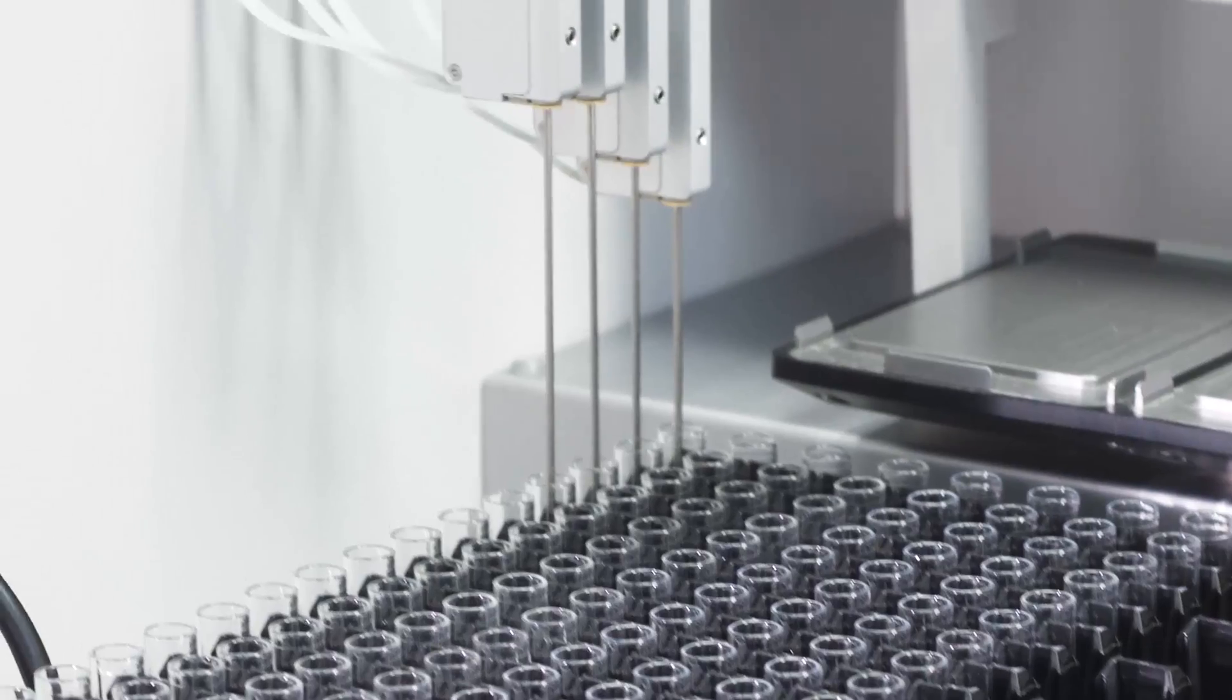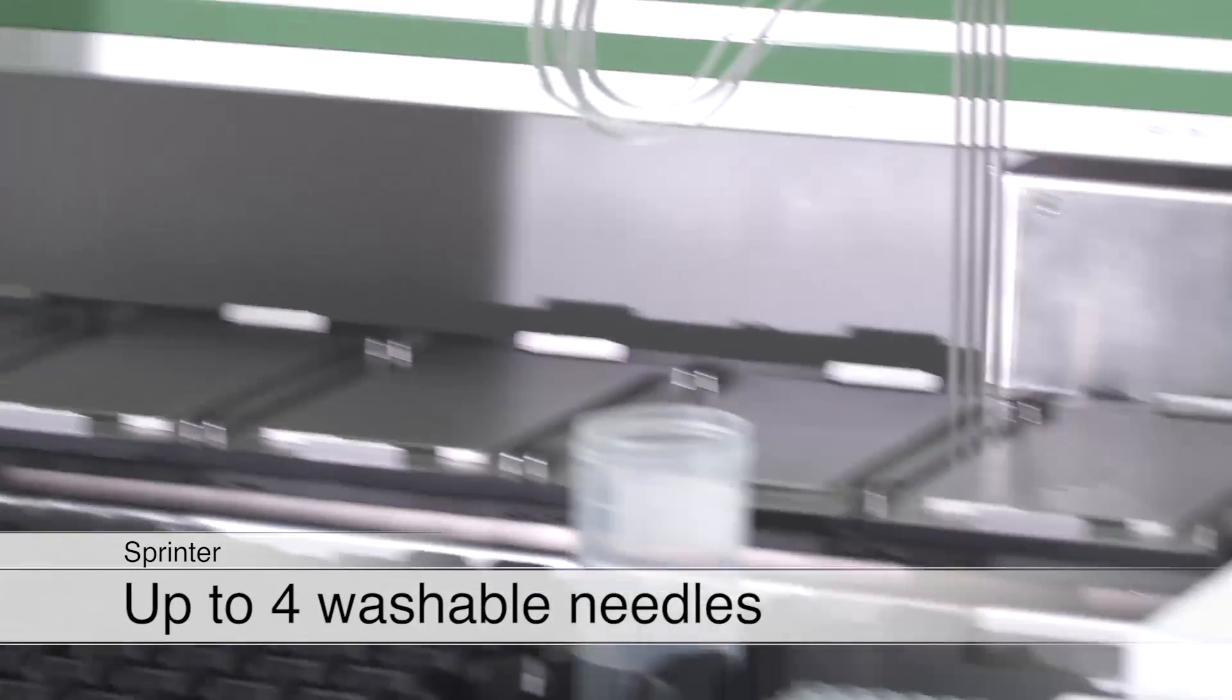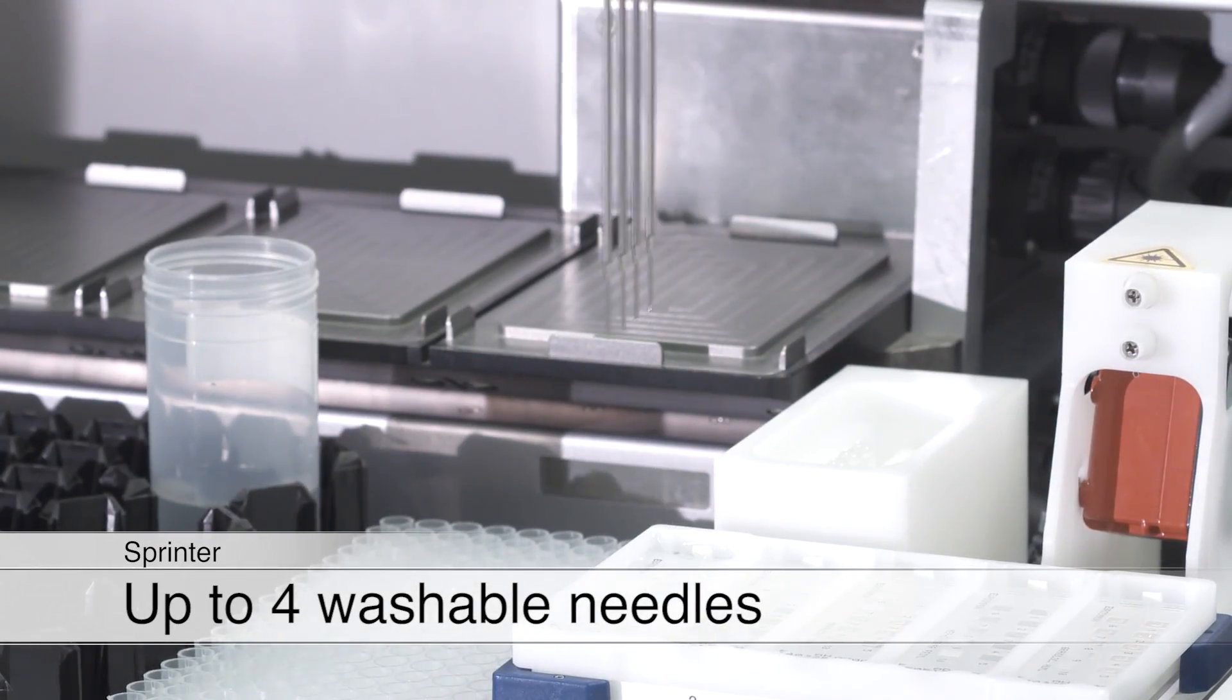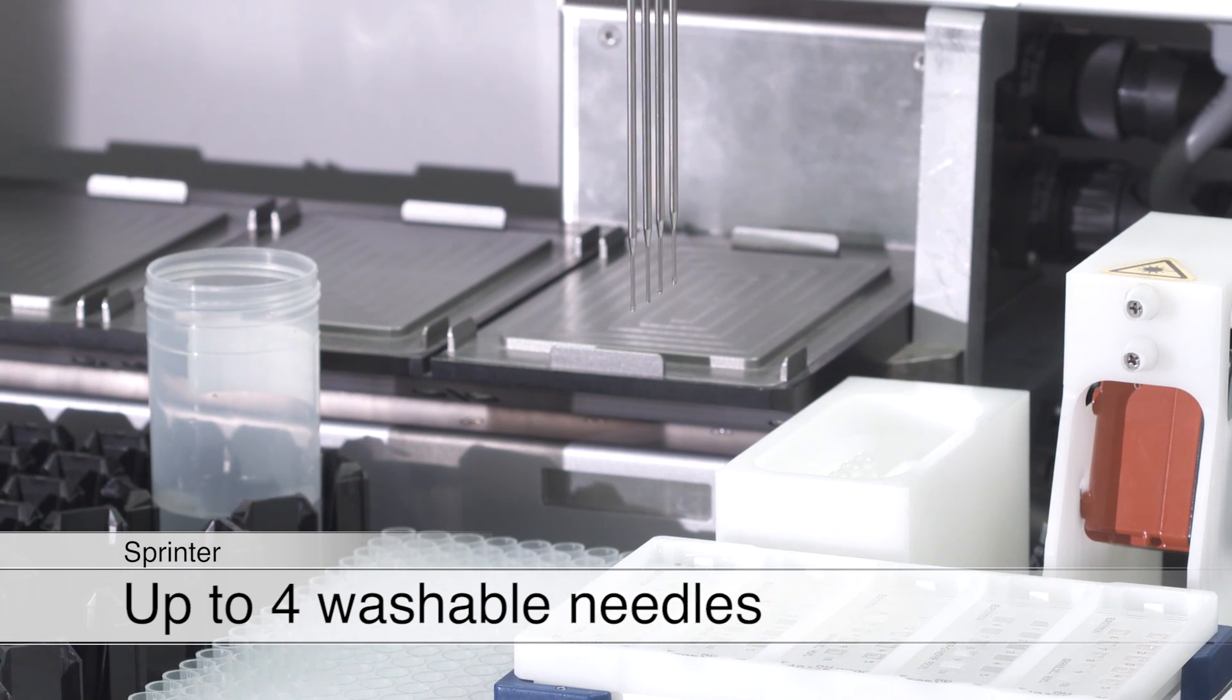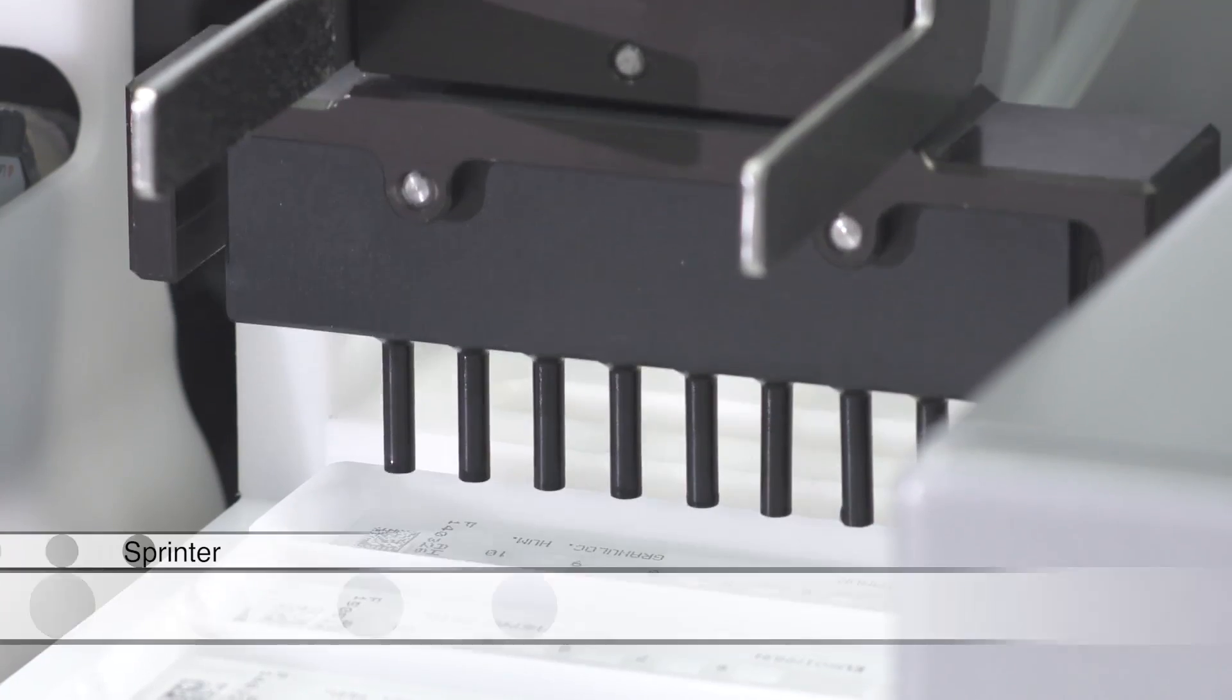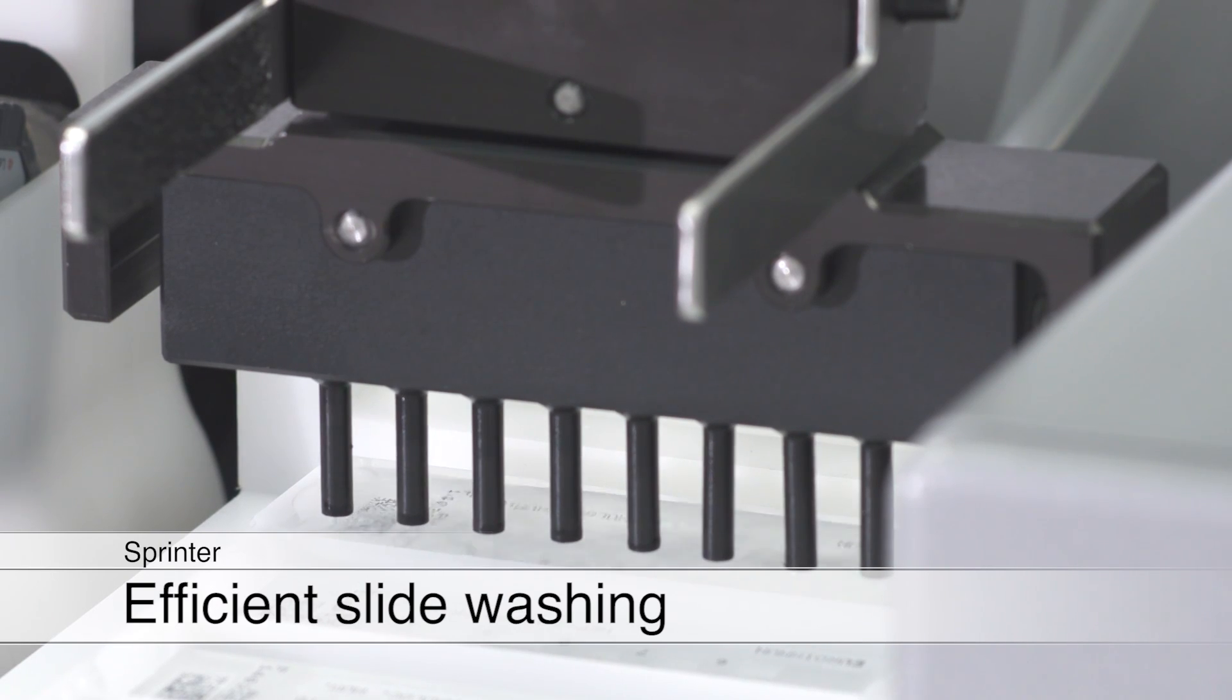Up to four washable needles transfer the diluted samples to the object slides. After incubation, these are flooded multiple times in the respective chamber for efficient washing.